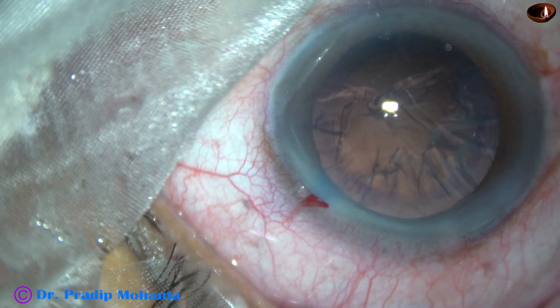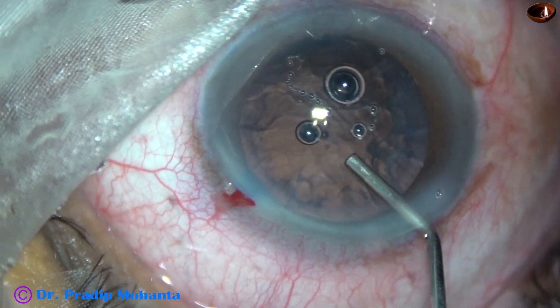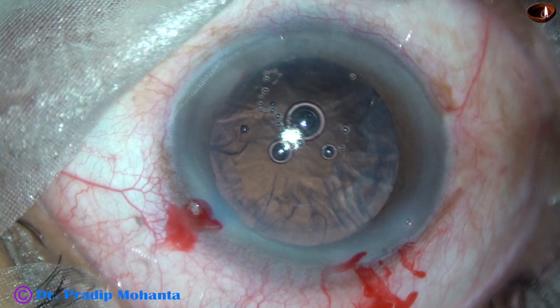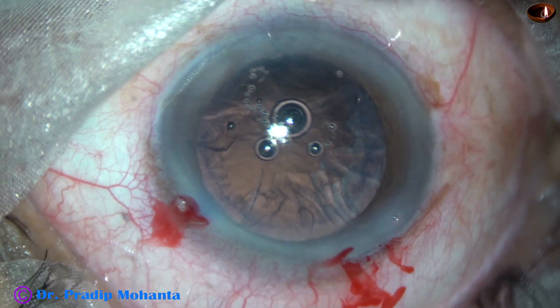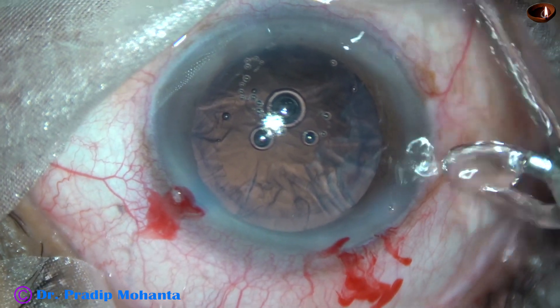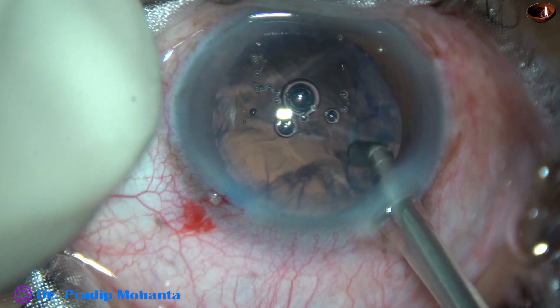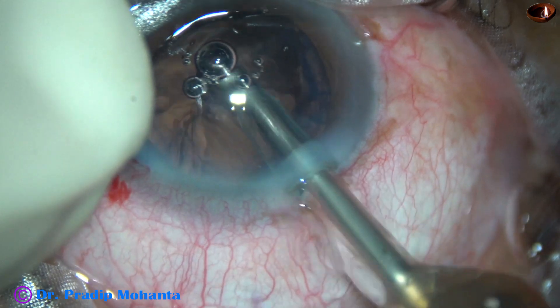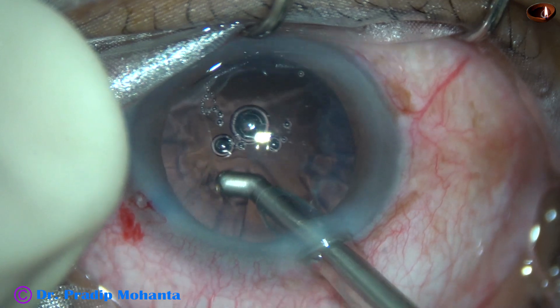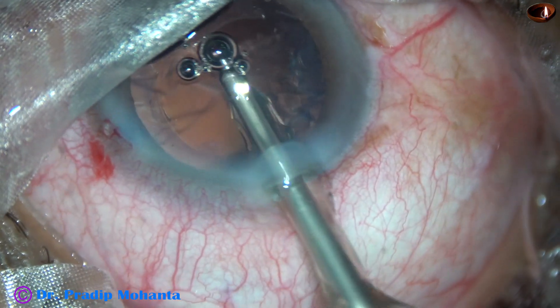This coaxial IA is good — it has a curvature, a bend at the tip, and it helps in removing the sub-incisional cortex. This is the coaxial IA from Oatley. We can remove the sub-incisional cortex in this way. It is always better to attack the sub-incisional cortex first before going to other areas.